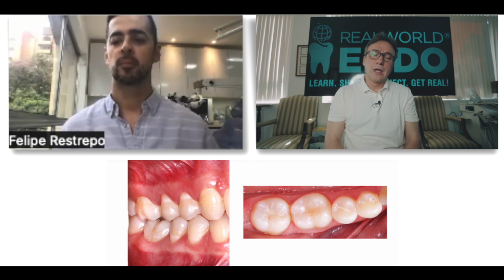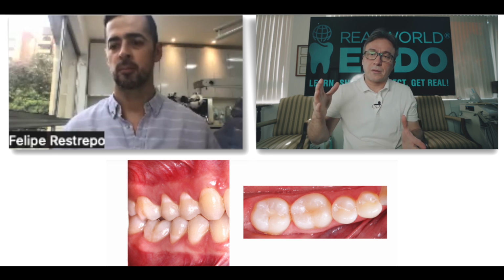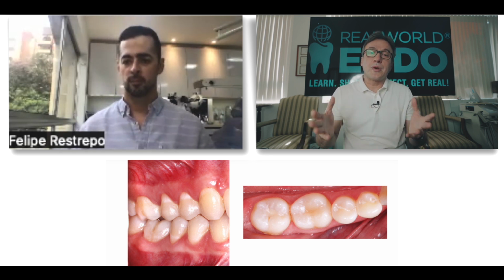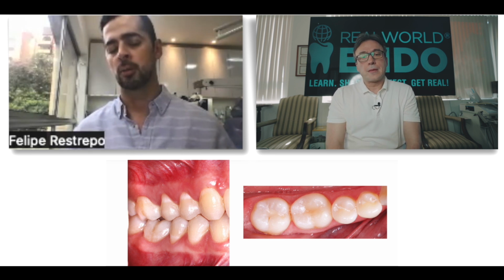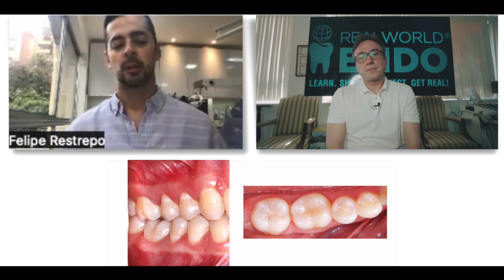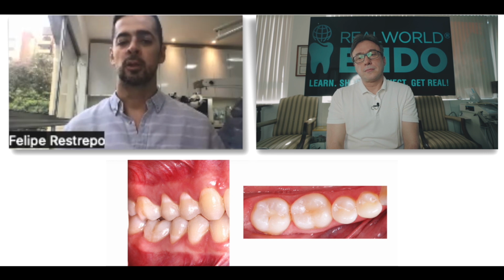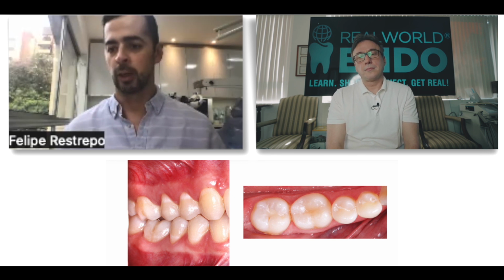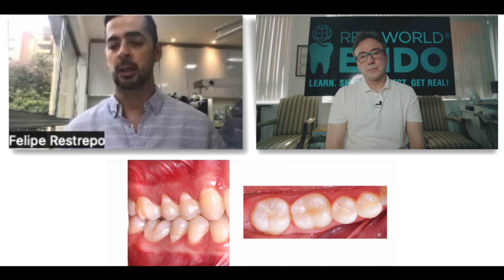And speaking of that, if you do end up perforating, especially in that previous case with the concavity on the bone, is it the same problem that you get sometimes with implants with thread exposure, or you don't happen to get that as much with natural teeth, would you say? No, there's no problem here, because we have a sound periodontal ligament and cement. As long as you have that, you're going to have bone either way. And also that you don't perforate the flap. If you don't perforate the soft tissue, the healing is going to happen.